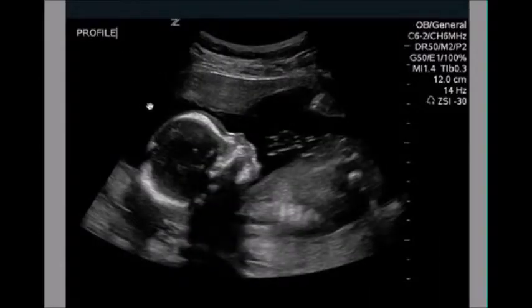In this example, the baby's head is pointing up because the dot is on the left side, which is pointing up. So this is breech. The birth canal is down here. The baby's feet is down here. So this is a breech presentation, and you definitely want to know if the baby's breech before you deliver, because it's much more difficult to deliver a breech baby. Again, this black area is amniotic fluid.